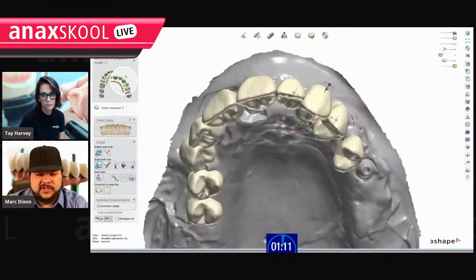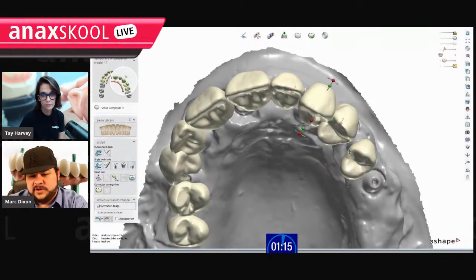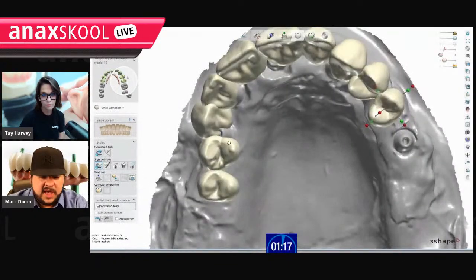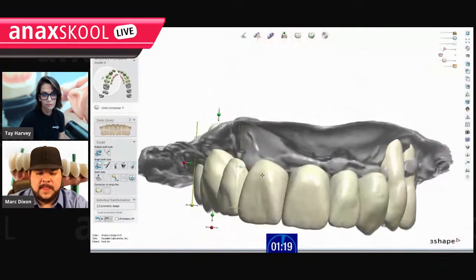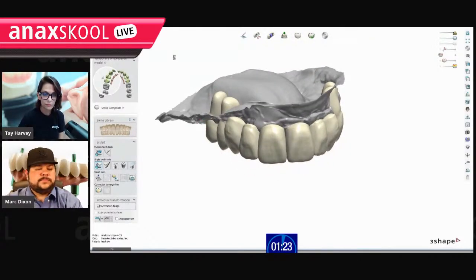So let's say I just used all my tools. Okay. And I'm done with my wax up now. They do need to be touching because it's been bridged. I'm done with my wax up, right? It looks beautiful, right? Isn't that gorgeous? So we're going to hit next. I hope I get an error though. So most of the time it's funny, even when we do it my way.